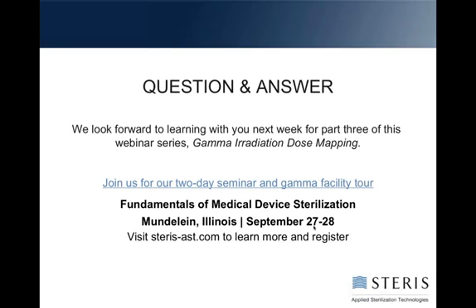Okay, and we just have a few more questions here. Could you provide the clause in the standard in which we can review the information related to the percentage of recovery for the bioburden process? I don't know the clause, but it's in 11737-1. It says in there that it is recommended, if the recovery is low, to repeat it. There are products that will have naturally low recovery efficiencies even if you repeat them, but usually you're going to be expected to have at least repeated the test a second time to see if you can improve it.